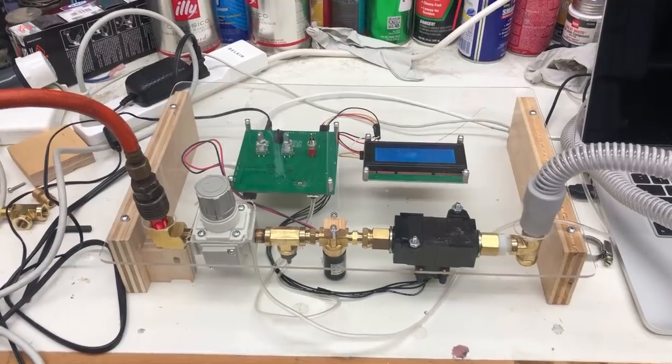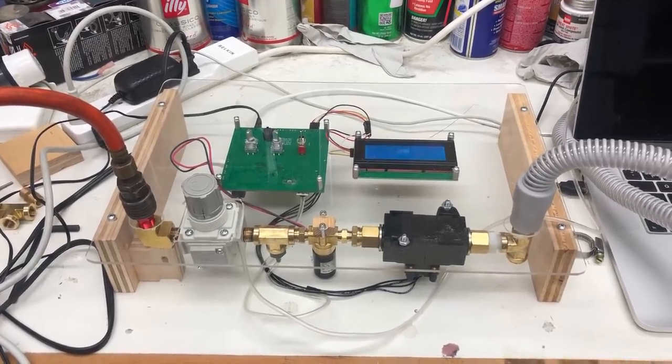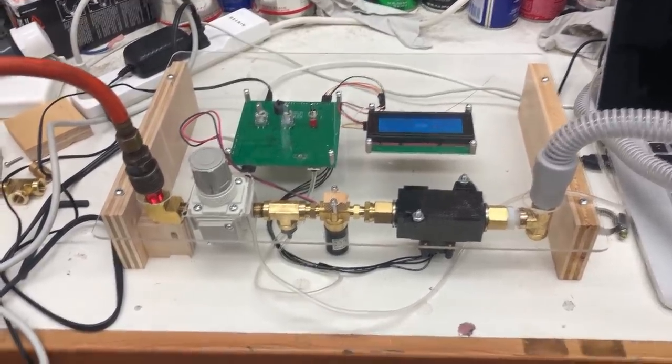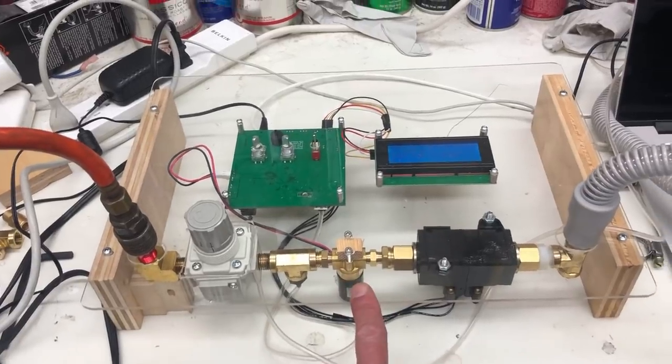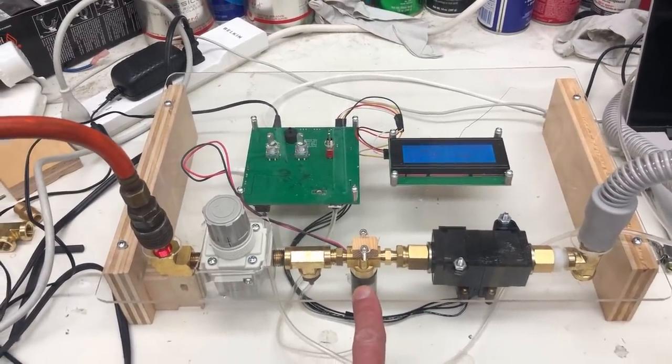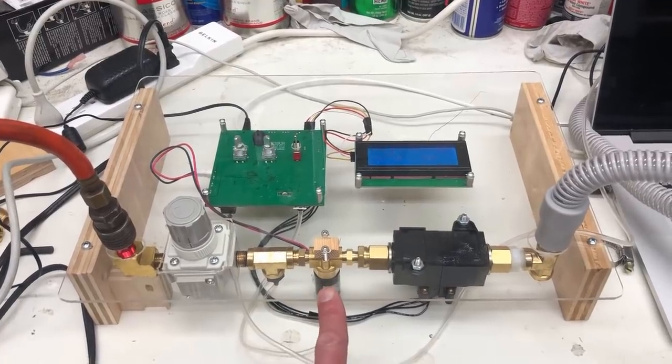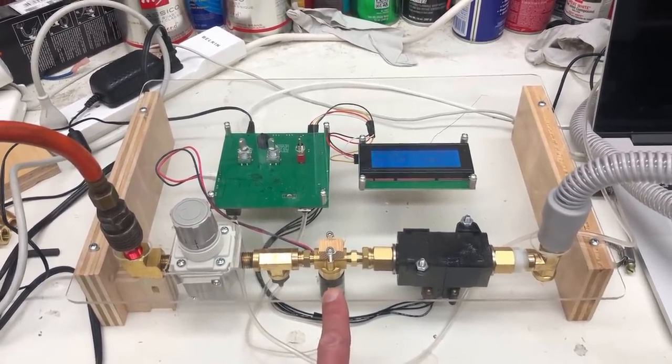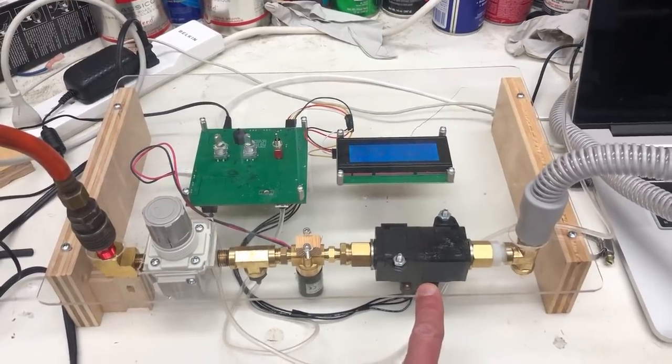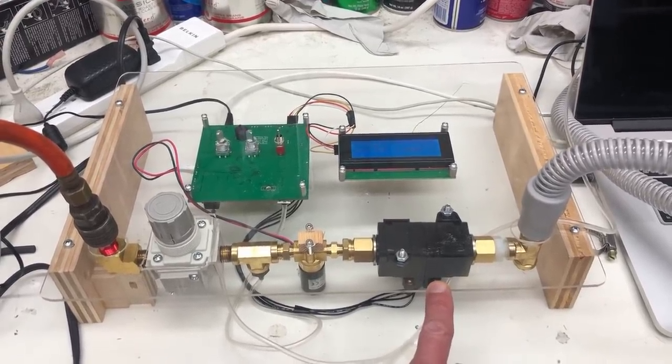To do that and keep the ventilator very simple, we designed a ventilator with just two key components. A proportional solenoid valve, this unit here, that can very quickly with 10 millisecond response time meter the flow very precisely, and a flow sensor so we can have feedback control giving very precise measurements.